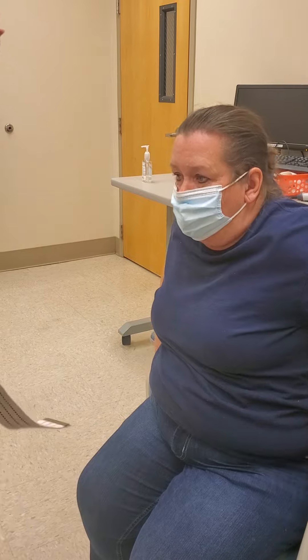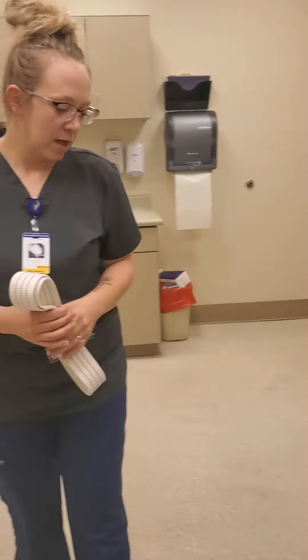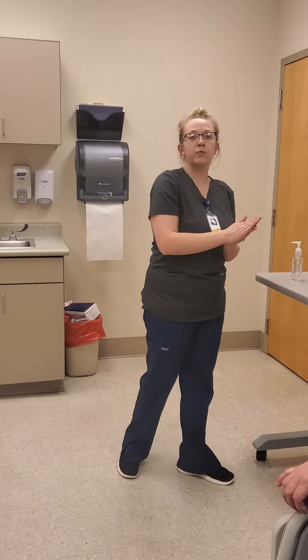Would you like me to remove your socks? No. All right, thank you, Audrey. Thank you. After that, I'm going to perform some hand hygiene. And we are all done.